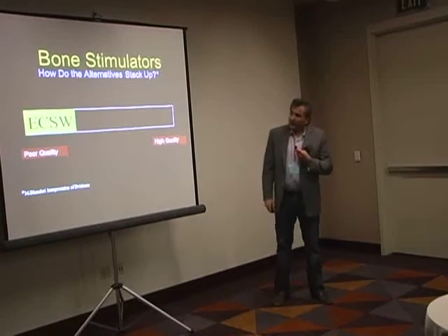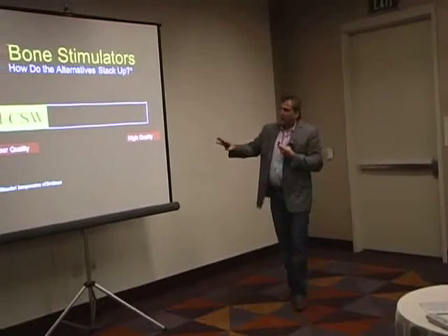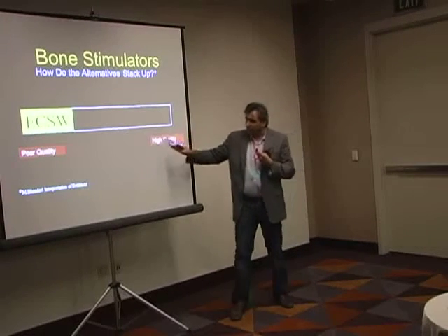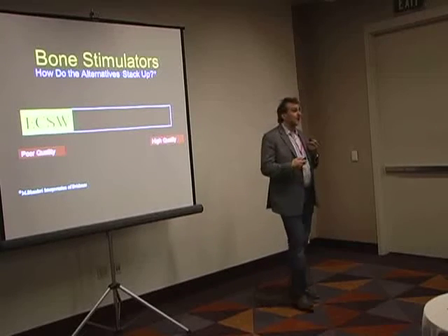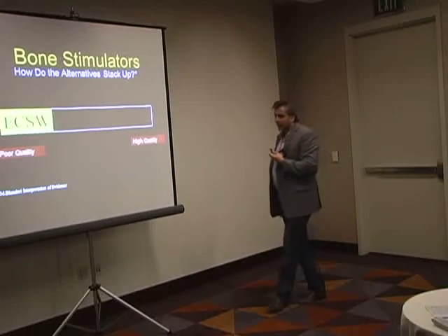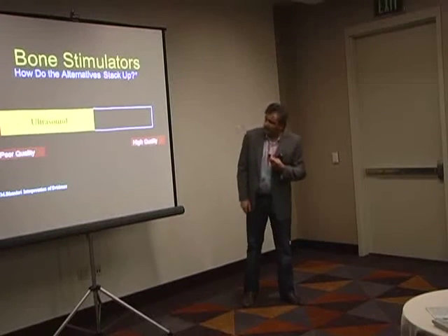But if I were to quantify what I believe, if you look at everything and you have a visual, you would probably say from the absolute gold standard, we should use it for every patient, versus poor quality, I'd say extracorporeal shockwave therapy, the data is still emerging. And it continues to grow, and there are some groups working hard at trying to get more data. So we're a bit early in that to be thinking about it. I would say ultrasound is roughly about there.